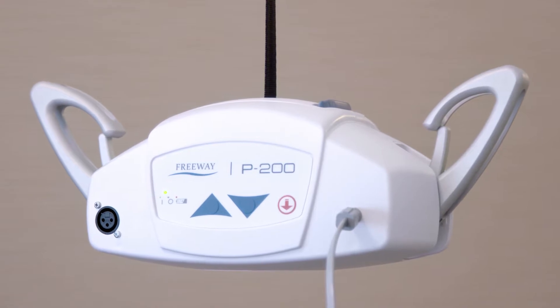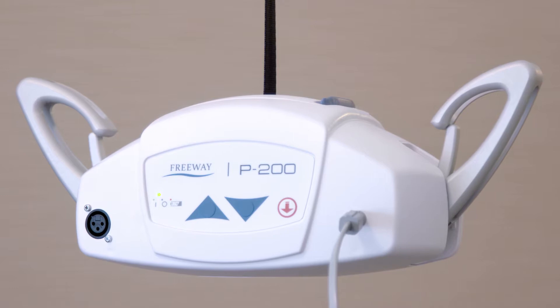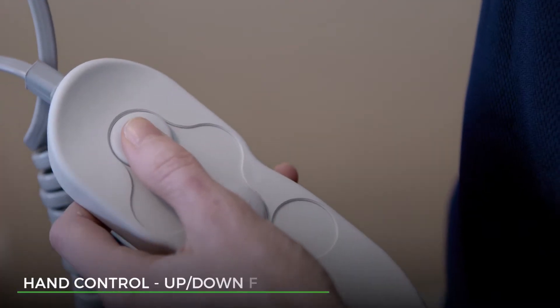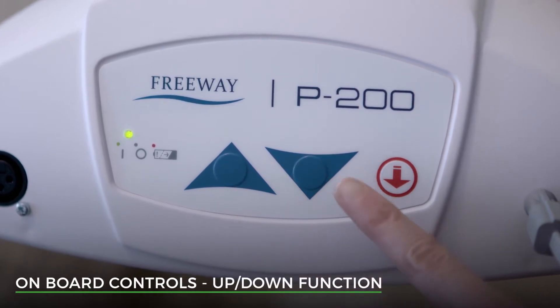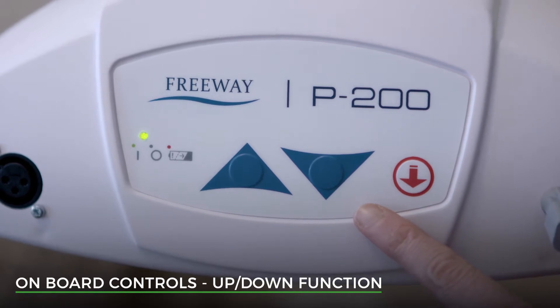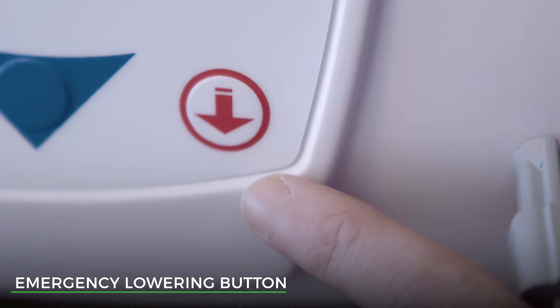Before using your P200, it is important that you understand the features and functions to get the most out of it. Using the hand control will allow you to move the hoist up and down. There are also up and down buttons on the hoist itself. Next to these, there is a red down arrow — this is the emergency lowering button and will lower the hoist in the unlikely event that the down button does not function.